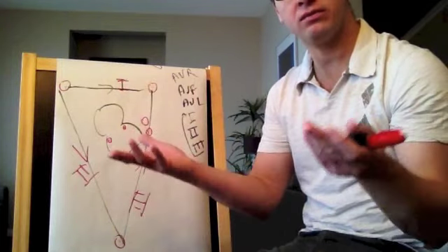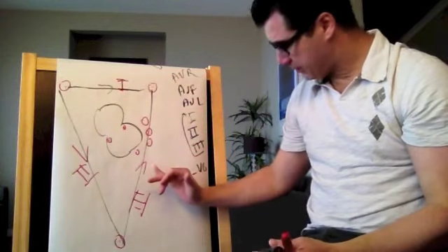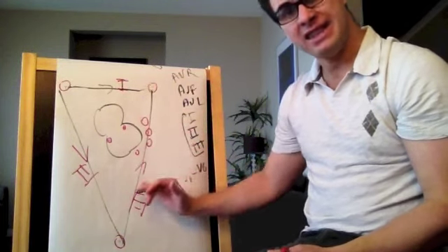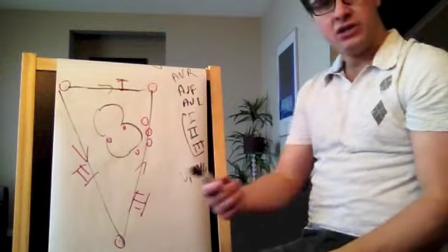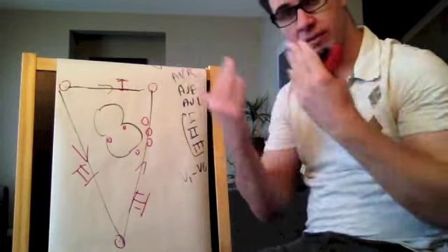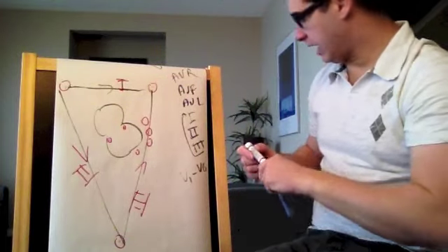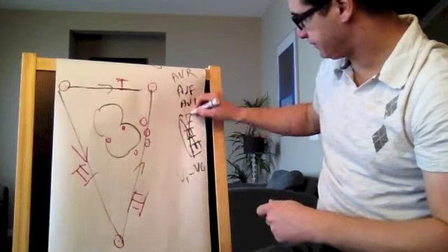Lead 2 is pretty much all positive because I'm seeing the electricity coming that way, going this way. So that's why in lead 2 it will be mostly positive, because the electricity is coming towards me, therefore it's positive. So that was for those three.